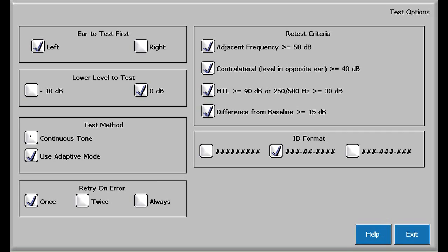Two options are available for test method. If continuous is checked, a one second tone or stimulus will be presented. If unchecked, then three 200 millisecond tones will be generated. The second option, use adaptive mode, if checked, will automatically slow the automatic stimulus presentation if the subject or employee is having difficulty taking the test.